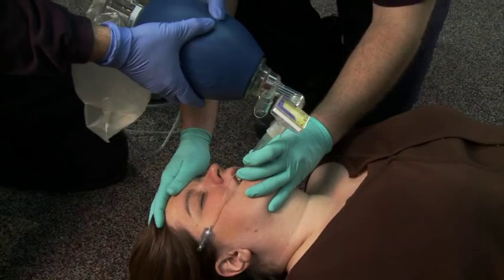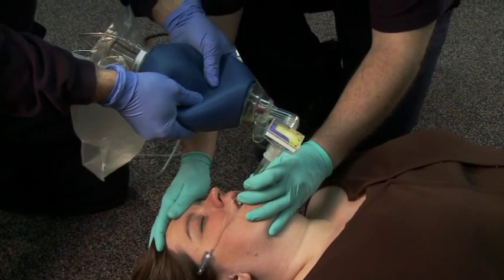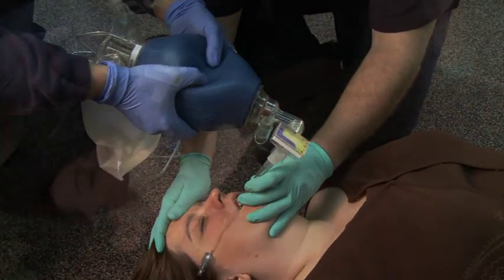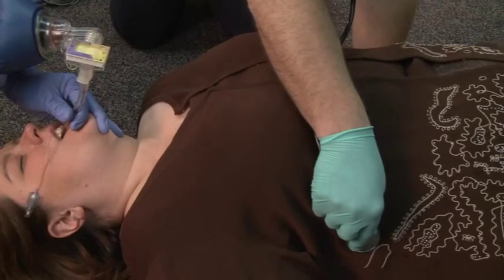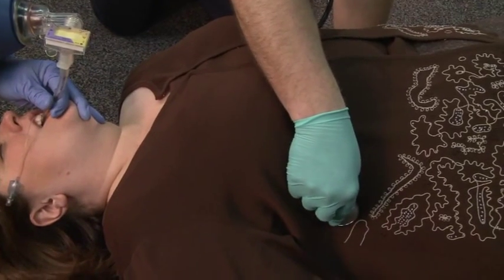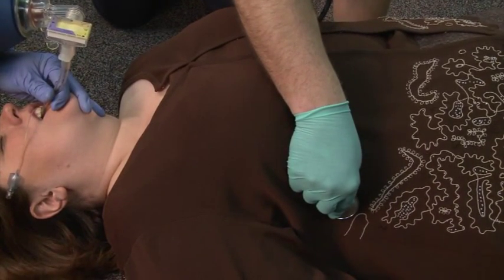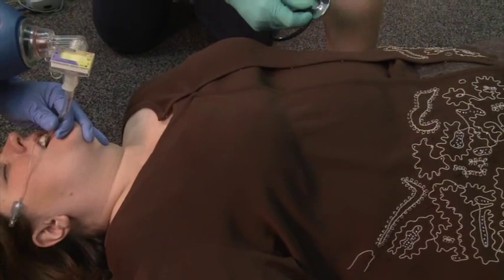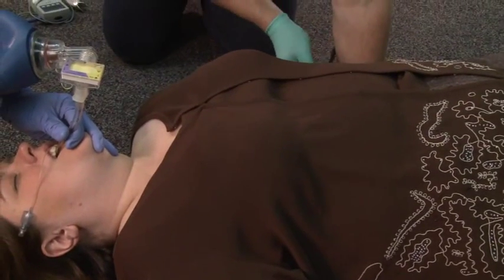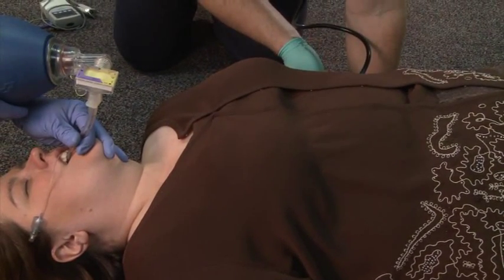Begin ventilations while auscultating for equal breath sounds and absent gastric sounds. Adjust the ET tube if needed to obtain equal breath sounds, then secure the ET tube in place.